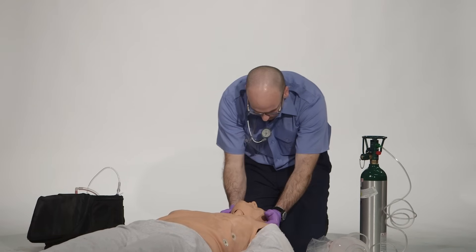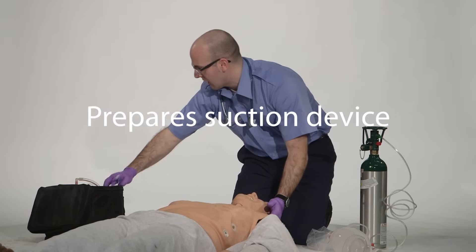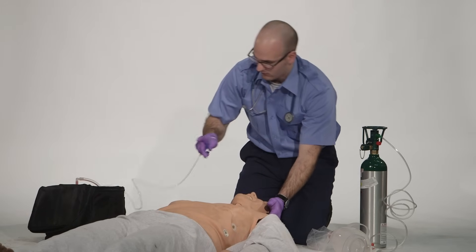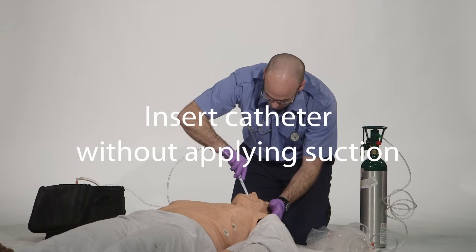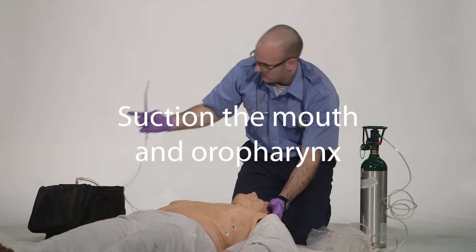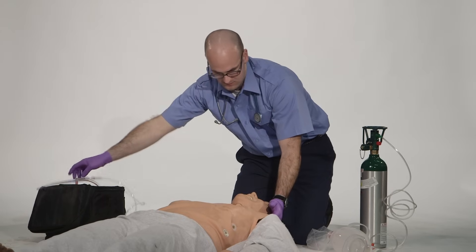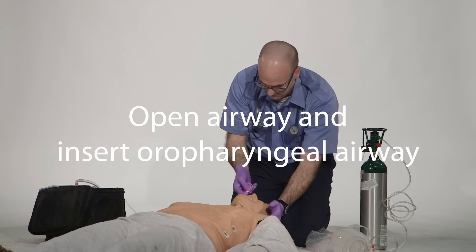Prepare a rigid suction catheter and turn on the power to the suction device or utilize a manual suction device. Insert the rigid suction catheter without applying suction, and suction the mouth and oral pharynx. Then open the airway manually and insert an oral pharyngeal airway.